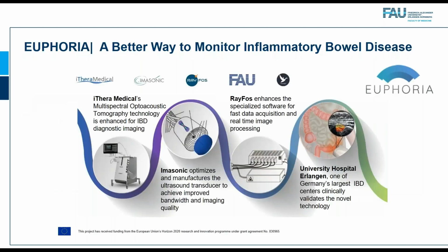To go on with our initial data, we set up several years ago a multi-center study, and we were lucky to get funding from the European Union within Horizon 2020, together with iThera Medical, Imasonic, and Rayfos, to perform a multi-center study for clinical approval of MSOT in IBD patients.